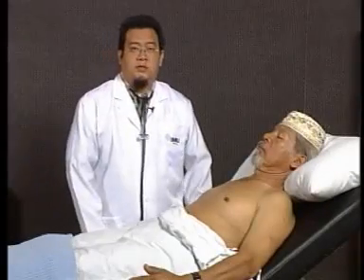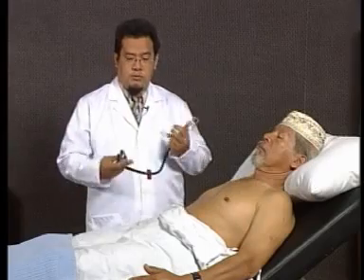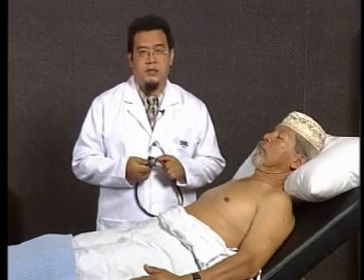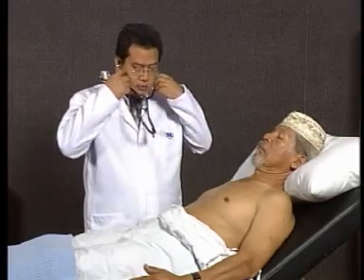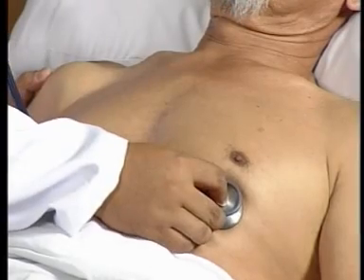The next sequence of our examination is auscultation of the precordium. Before we use our stethoscope, we must make sure that the position of the stethoscope is well defined. One is the diaphragm, the next is the bell. Diaphragms are for high-pitched sounds and the bell is for low-pitched sounds. The first area for auscultation is the apex, and it is important for us to position our diaphragm at the area where we felt the apex beat.